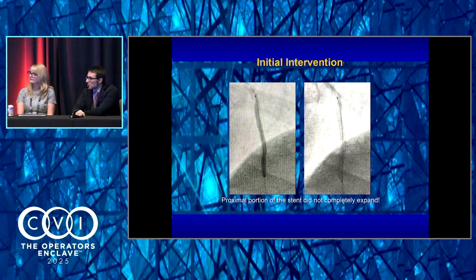Yeah. Sure, Alison, what would you do at this point? So you put a stent in, there's a dent. No, we want to understand the distribution of the calcification in this case.